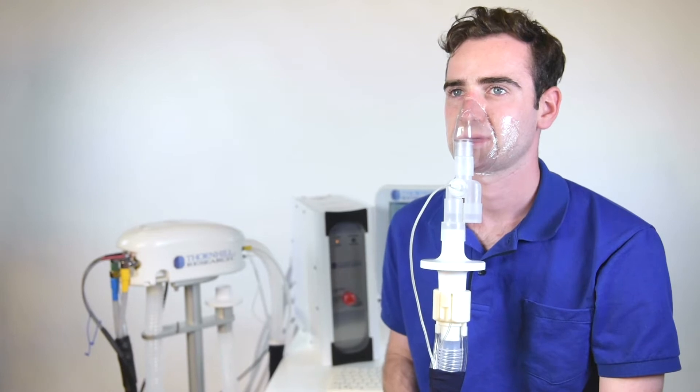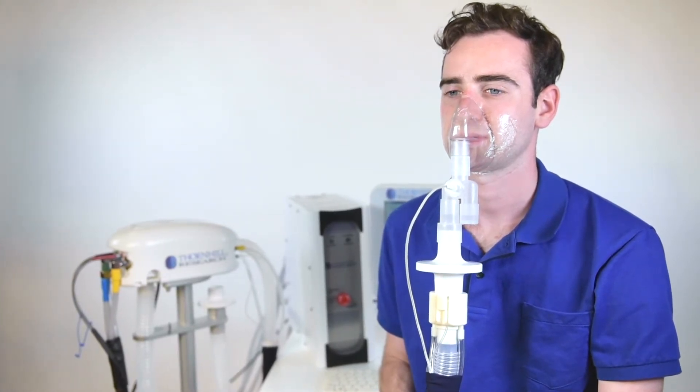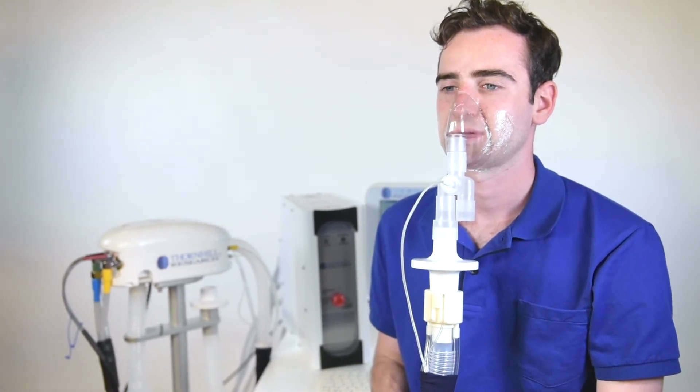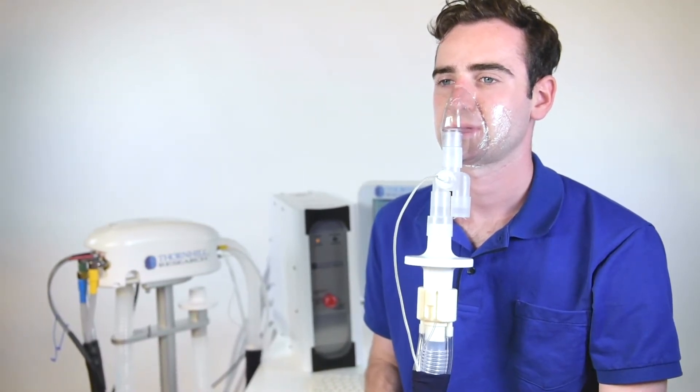The ResPRAC gas control system is an investigational device used to precisely target and control arterial pCO2 and pO2 in spontaneously breathing subjects. ResPRAC can be used to provide a standardized and repeatable stimulus in diagnostic procedures to assess vascular reactivity. This video will provide a simplified explanation as to how ResPRAC is able to safely control blood gases.